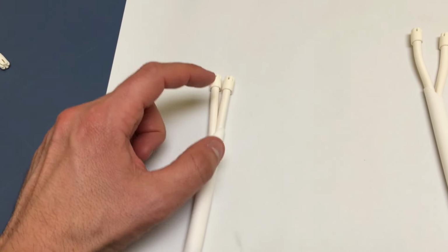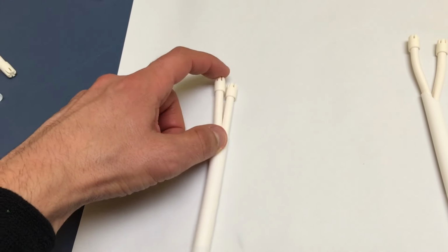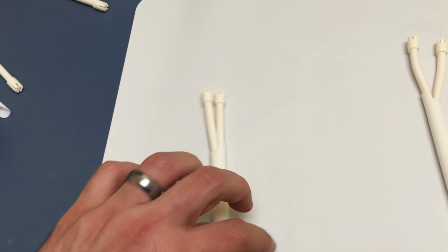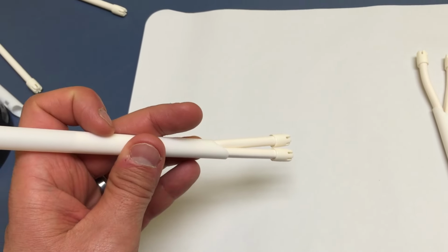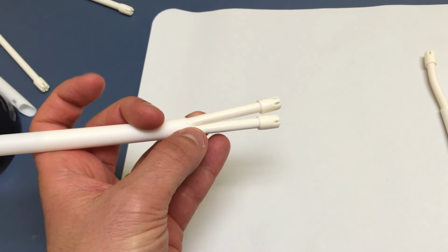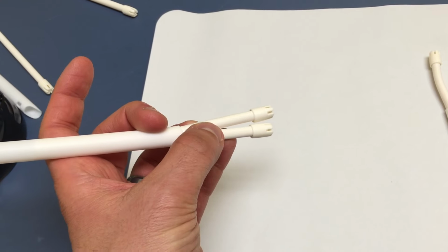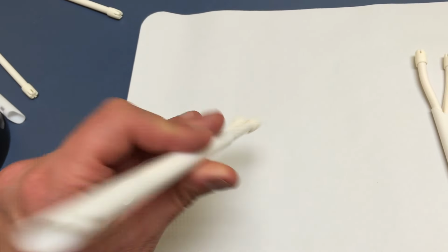That's long enough to keep this pretty stiff, because I use it for two things. One, I've been using it to retract the tongue while I'm power scaling. You get a lot of suction power from the HVE tip spread out through the two saliva ejectors, so you don't get much tissue suck.